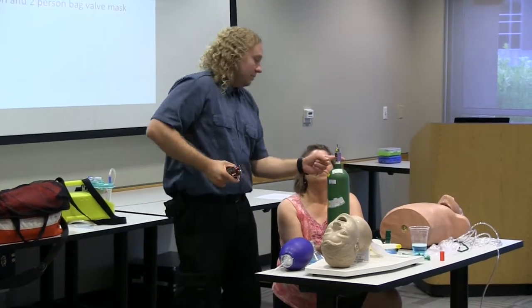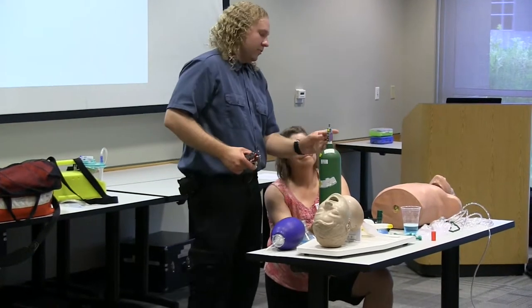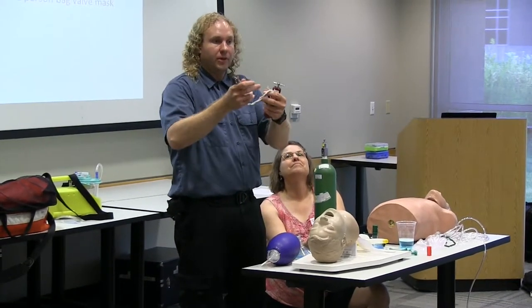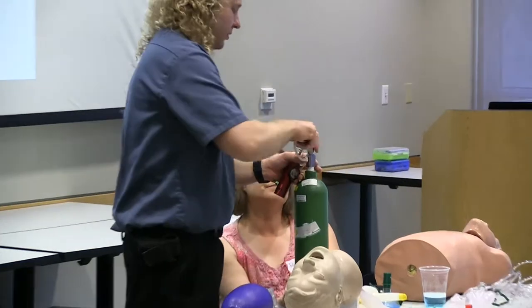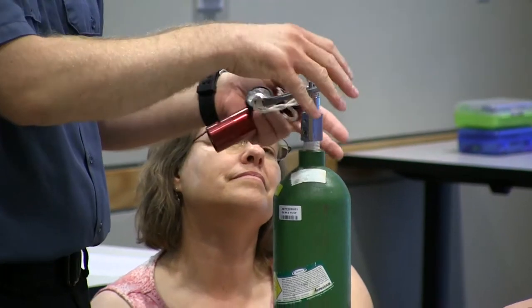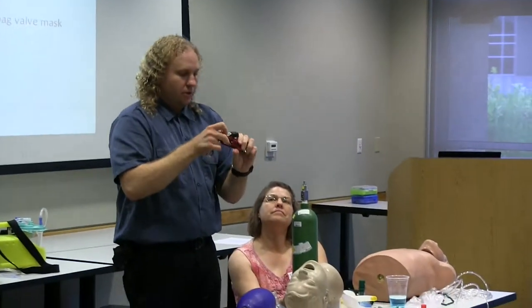With the oxygen tank, Peggy has very astutely pointed the opening away from her. There's an opening here that we want to make sure, as we do this first step, we're not blowing it into our face or somebody else's. We're going to clear this opening by just cracking the tank — crack it enough to blow any dust or debris out of there because we don't want that going into our regulator.